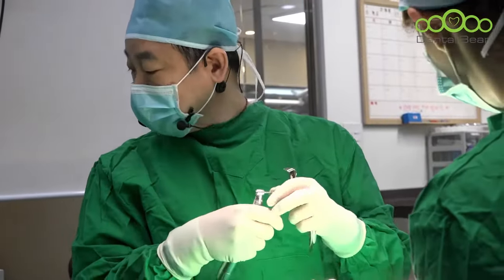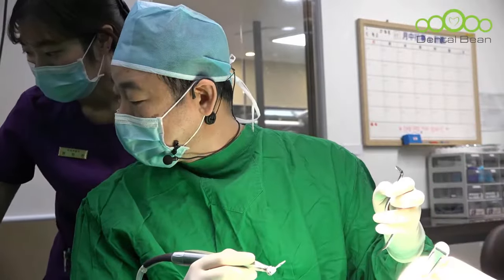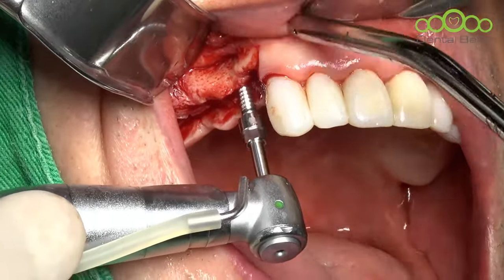Okay. Then I will use a set drill. Set drill, 50 RPM. Okay. I will expand the ridge with the set drill.